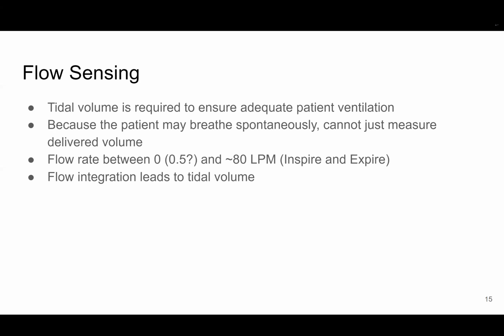This is just a thing we kicked off with in the last day, that this is going to become a larger focus area. So I'm going to type up a better specification that we can start sharing on what we need to accomplish. But just at a high level, we're looking between a flow rate of 0, or maybe a sensitivity around 0.5 liters per minute would work, depending on what logic we can write in there, and then up to 80 liters a minute for peak expiratory flow.